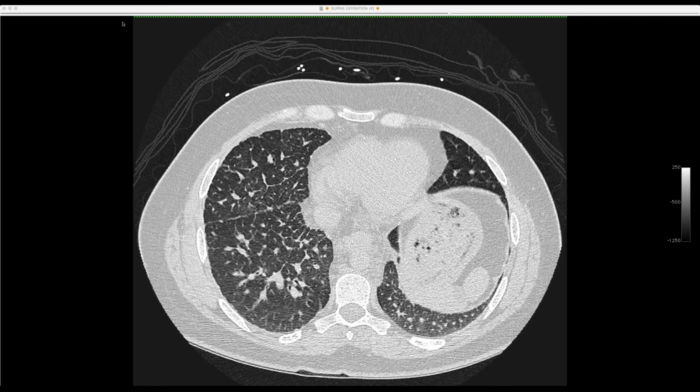lung lymphatics. But I think that's the value of the lymph angiogram, because if you can show the lipiodol sort of spilling into the airways, it sort of confirms the diagnosis without having to do a wedge. And you know, our pathologist was debating whether a wedge would really be that helpful in this case, since it seems to be pointing at that.